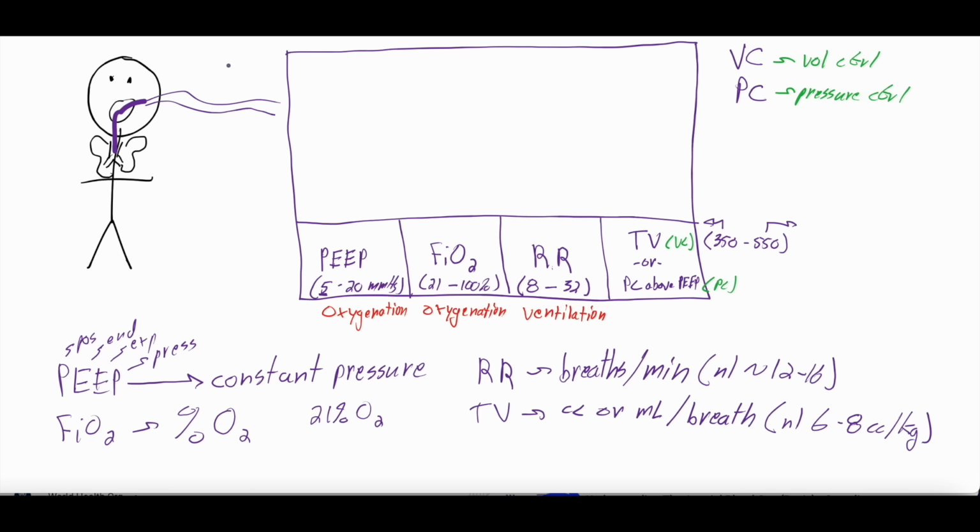So if I set it to 20, what that means is I'm telling the ventilator with every breath, I want you just to put 20 millimeters of mercury of pressure into that tube, and whatever volume that leads to the lungs inflating is just what it is, right? And this is usually pressure control above the PEEP. And, you know, there isn't necessarily a normal. You typically don't want to go for both PEEP and pressure control combined, so adding these together, above 30, but you can. It's not a law, you can. It just might cause some barotrauma and things.